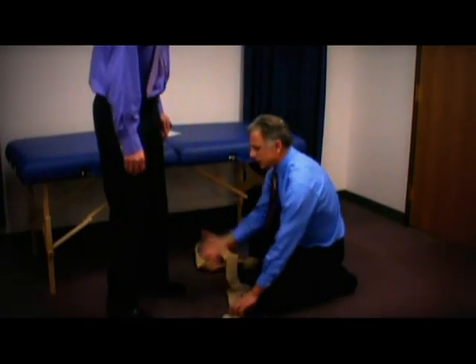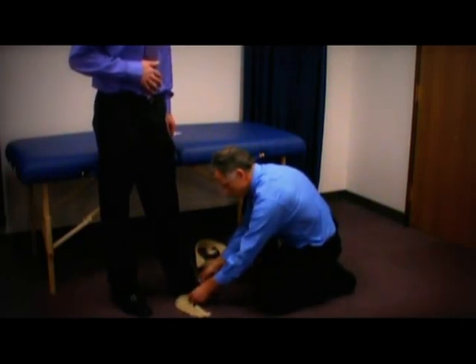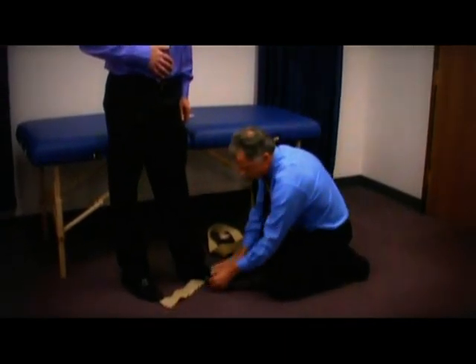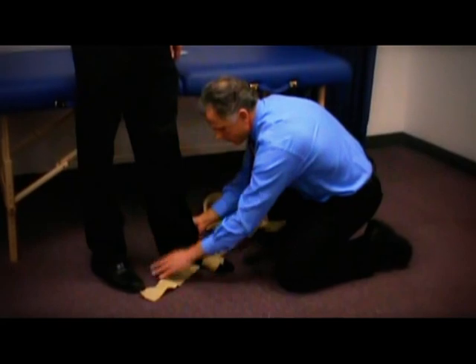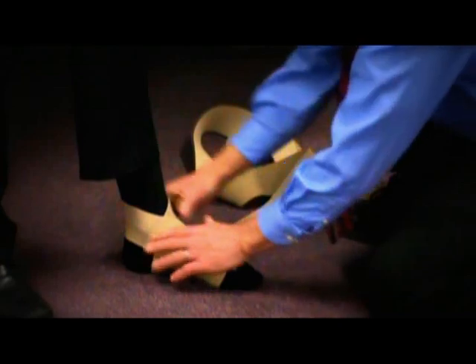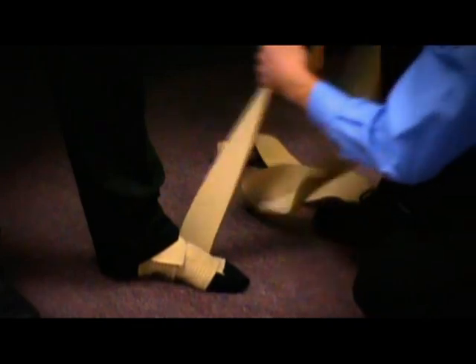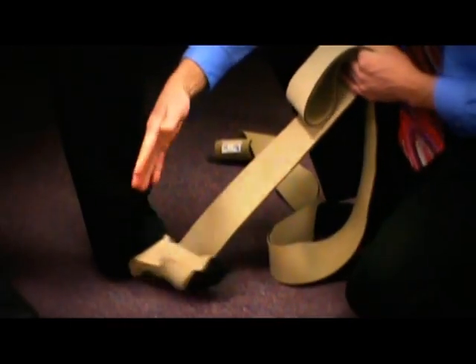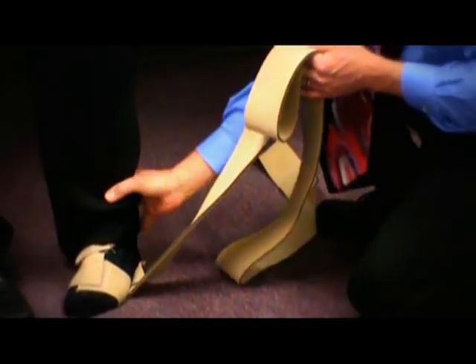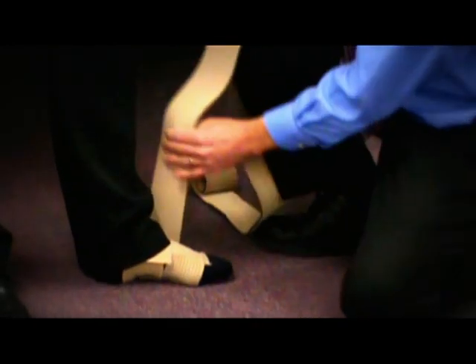So it's easiest to explain just by putting it on, and then it'll make a lot of sense as opposed to us just having it. So I'm putting my foot on. Go ahead. Put my forefoot right on here. Can you catch that, Nancy? And then you wrap around the forefoot. So that's one Velcro strap there, and this one wraps around like this, and we've got it attached to the two Velcro foot straps. Now you can put this on this direction and you come towards the inside, that'll help turn the toe in. If the person actually toes in inadvertently, then you can go the other direction to help bring the toe out. Probably most of the time people toe out, I would say in the majority that I see.